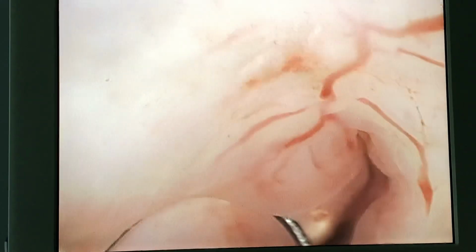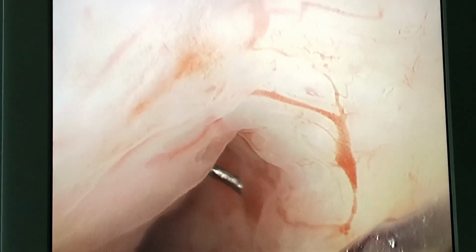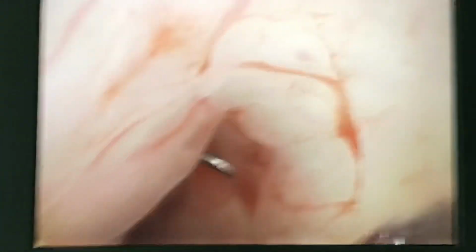This is the small blood vessels. Look at even the RBCs here. You see the flow of the RBCs? You see that? This is the flowing RBCs, the small red blood corpuscles, okay? That's an amazing view. Look at this, come zoom in on blood vessels. Zoom in more. Do you see that?